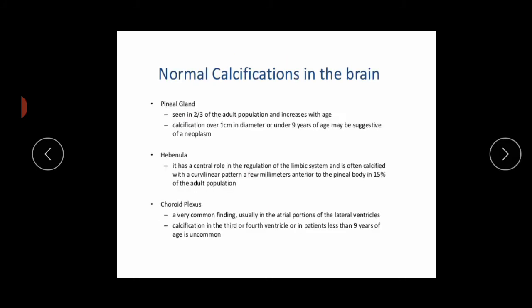Normal calcifications in the brain: the pineal gland is seen in two-thirds of the adult population and calcification increases with age. Calcification over one centimeter in diameter or under nine years of age may be suggestive of neoplasm. The habenula has a central role in regulation of the limbic system and is often calcified with a curvilinear pattern of a few millimeters, anterior to the pineal body, in 15% of the adult population.